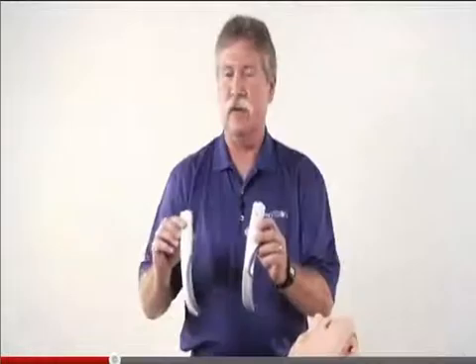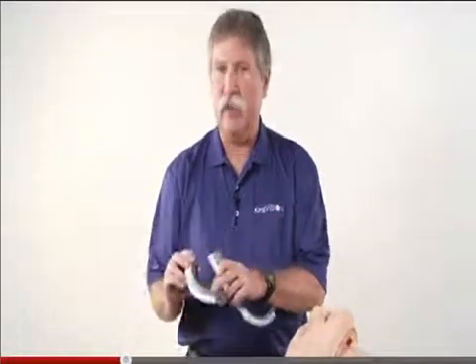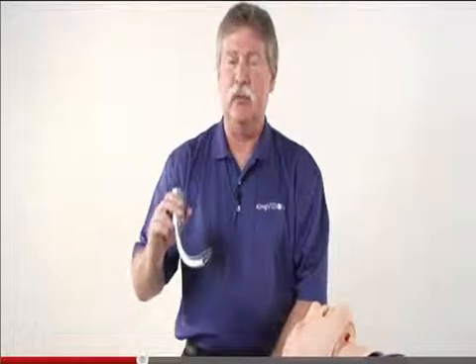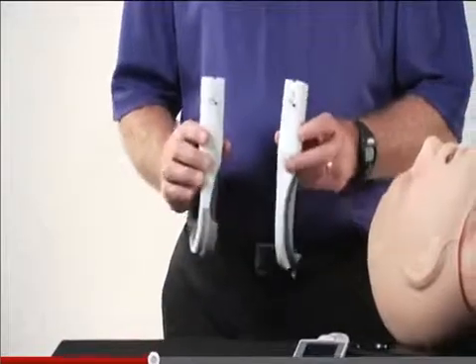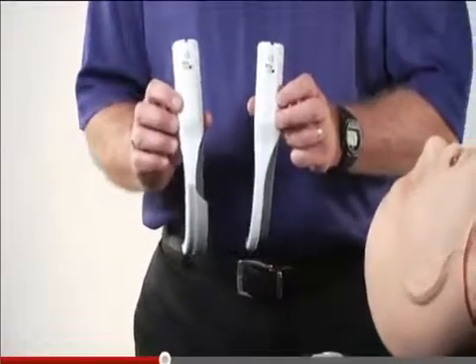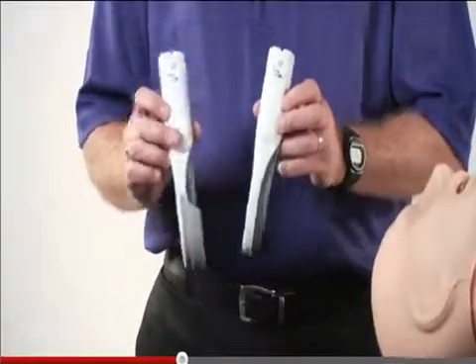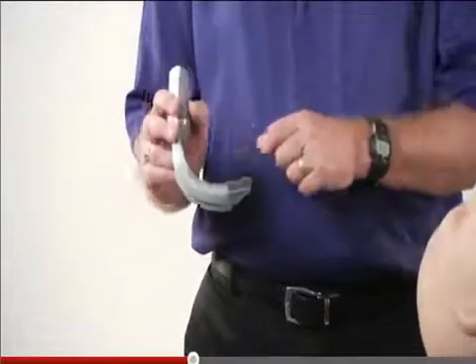There are two blades that are available with a guiding channel and without a guiding channel. This will not require the use of a stylet. The standard blade will require the use of a stylet. Currently, the disposable blades are available in a size 3, which is appropriate for most adult patients. It would be analogous to a size 3 Macintosh standard blade. The channeled version accommodates standard tracheal tubes 6 through 8.